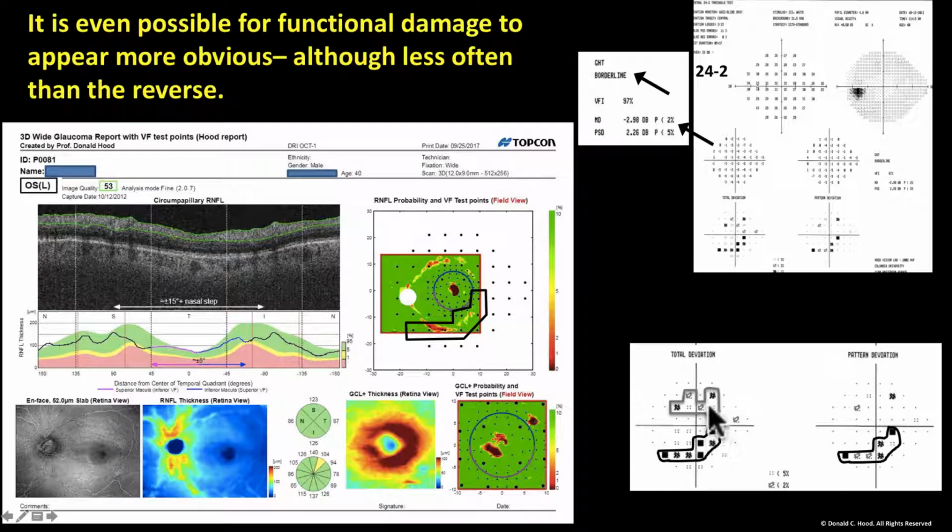Same thing. I believe this is clearer than what you see here. So this, by the way, corresponds to this location over here. So you can see it's borderline. And this corresponds to the location here, which is in the green, or this part here is borderline.